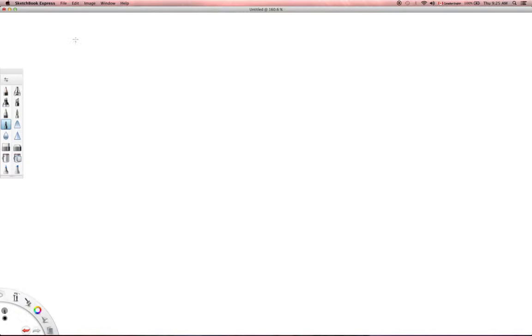Really what's going on is we're performing something called hemoximetry. I'll just throw that word up there. Most people are familiar with this because there are machines called pulse oximeters, and we know this has something to do with light.